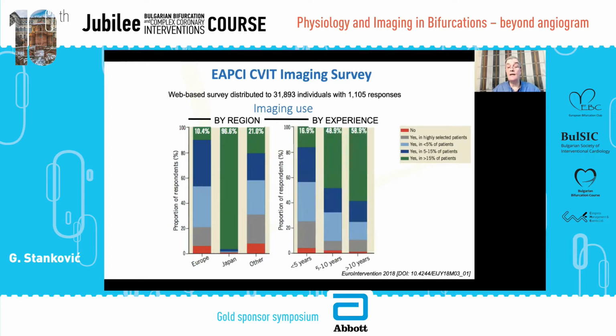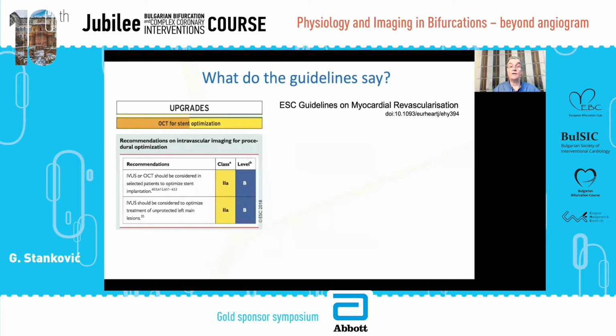Of course, it's very important to see the other question, how it goes with experience. We see that with increasing experience, experienced operators realize the value of image guidance and the impact on hard clinical outcome data. Operators with more than 5 or more than 10 years of experience are more and more using imaging. Among operators with more than 10 years of experience, 60% use imaging on a regular basis in more than 15% of patients.